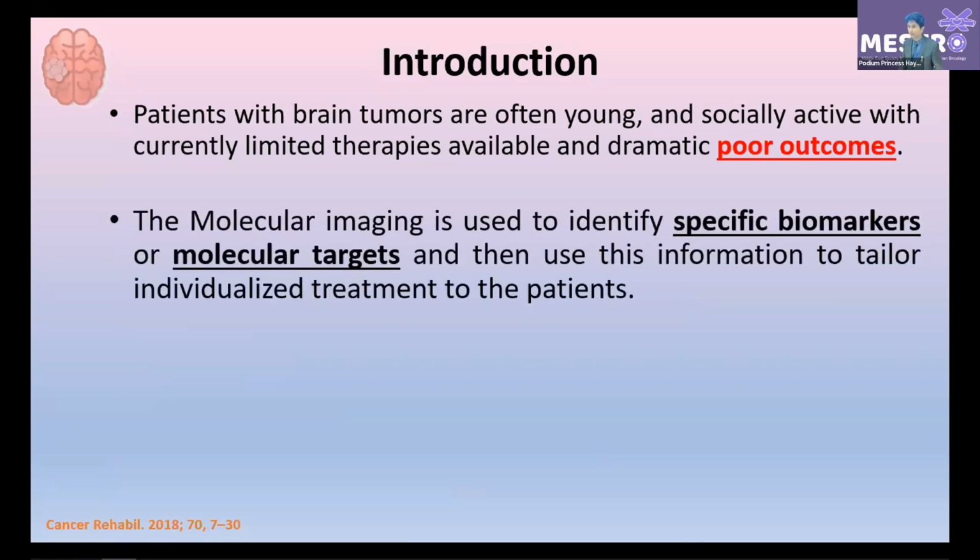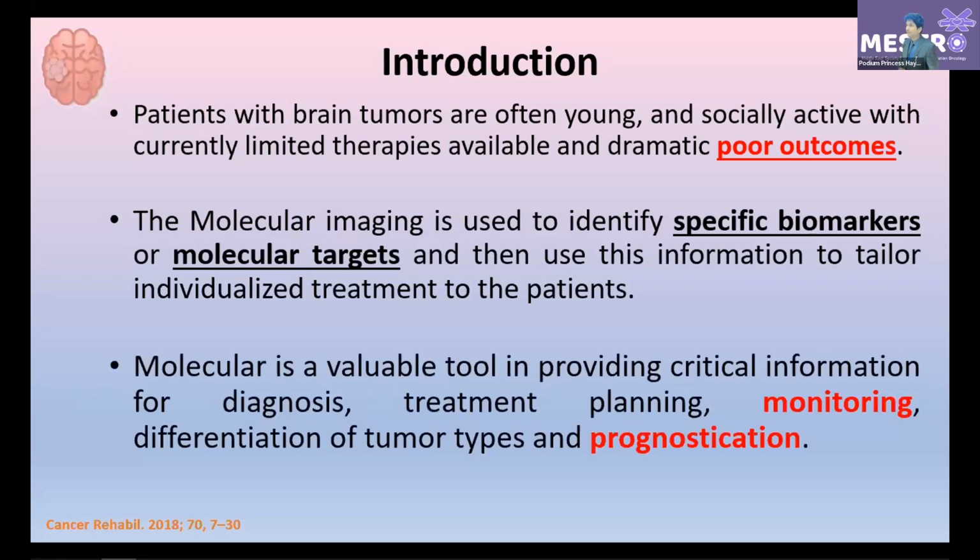Molecular imaging is a method used to identify certain specific biomarkers or molecular targets, and use this information to tailor individualized treatment to the patients. Molecular imaging is a very valuable tool, giving us diagnosis, treatment planning, monitoring, differentiating between the different grades of the tumors, surgical planning, and guidance for targeted therapy as well.